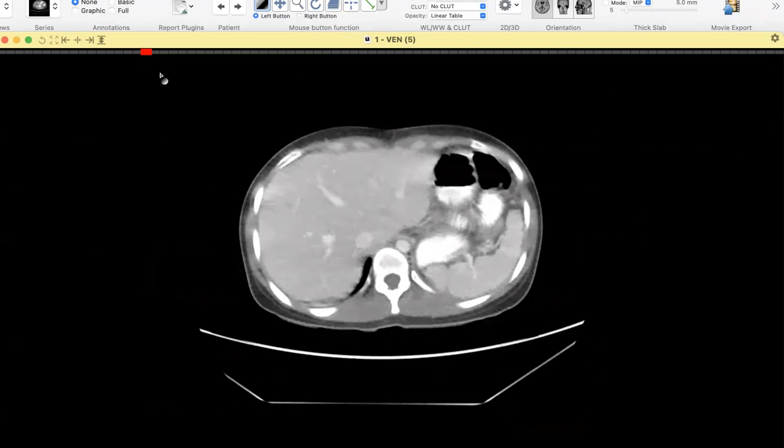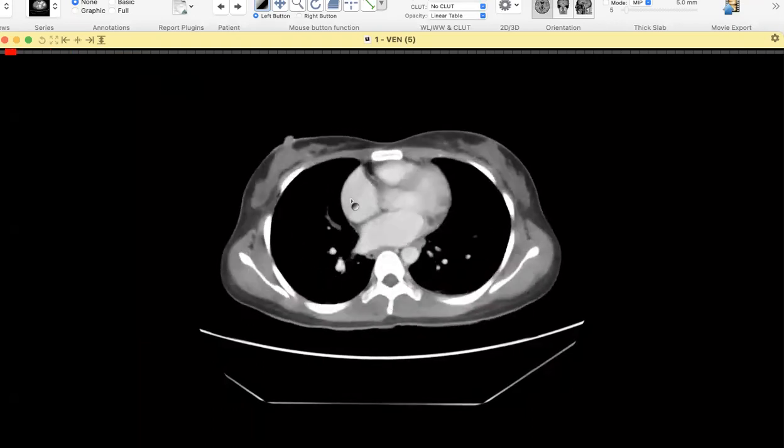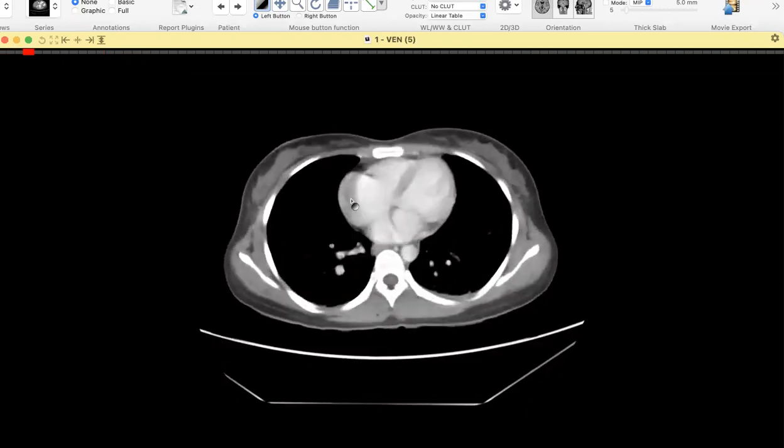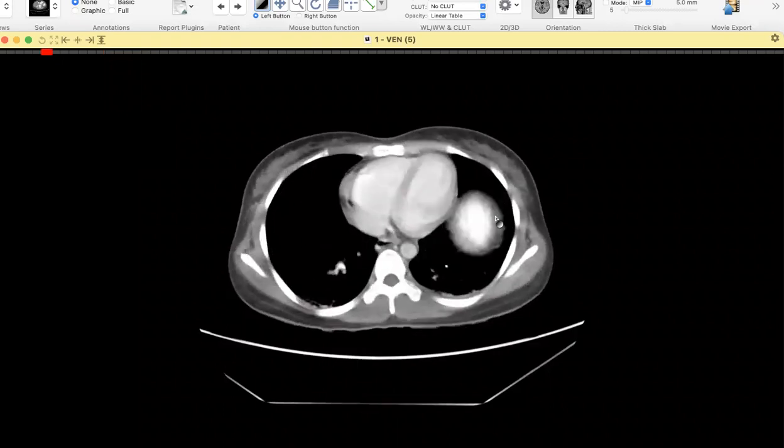You can hear me, right? Right now, yes, but I think I lost your voice. Sure. So did you get the history for this patient? Oh, no. 35-year-old female patient with pelvic pain and tenderness. Pelvic pain and, sorry, what? Tenderness. Okay. Yeah.